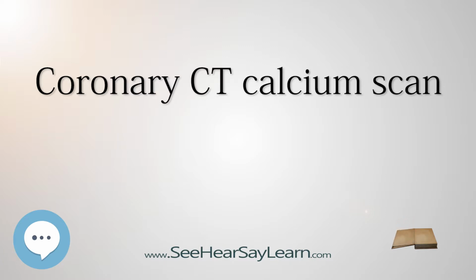However, coronary CT angiography, CTA, is superior to coronary CT calcium scanning in determining the risk of major adverse cardiac events, MACE. Agatston score. The Agatston score, named after its developer Arthur Agatston, is a measure of calcium on a coronary CT calcium scan. The Agatston score is derived from the work of Drs. Agatston and Janowitz of the University of Miami School of Medicine and dates back into the 1980s.